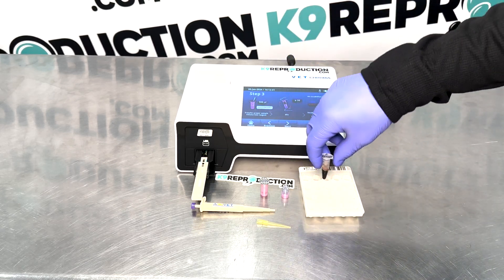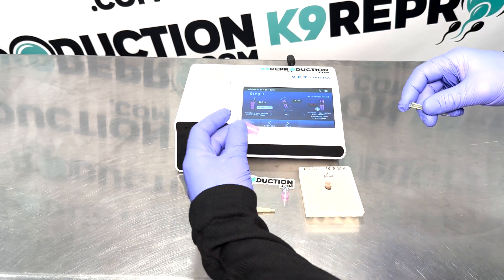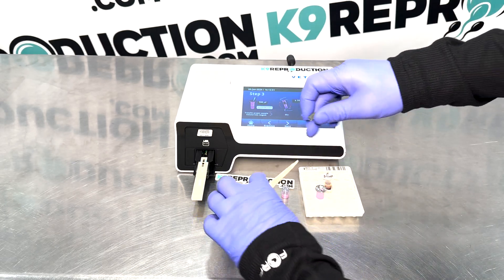After you've spun down your blood, ensure the serum is clear. If the serum is stuck together, you can mix it and re-spin it. If the serum has a tint of pink or red, you must re-draw and re-spin.